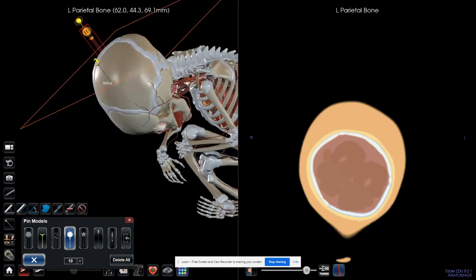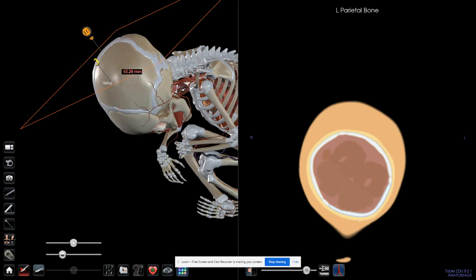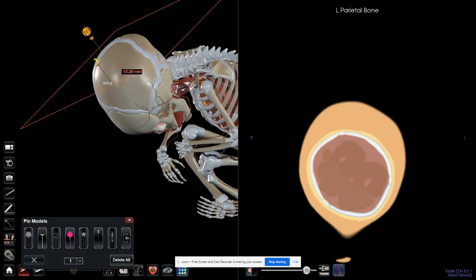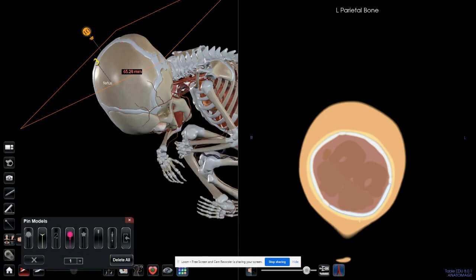The measurement here allows me to measure. If I want to take from here to here, the width of the left parietal bone is 65.28 millimeters, for example. We've seen the pin, and this is again the layout. If I want to remove all the pins, I simply click delete all or remove.